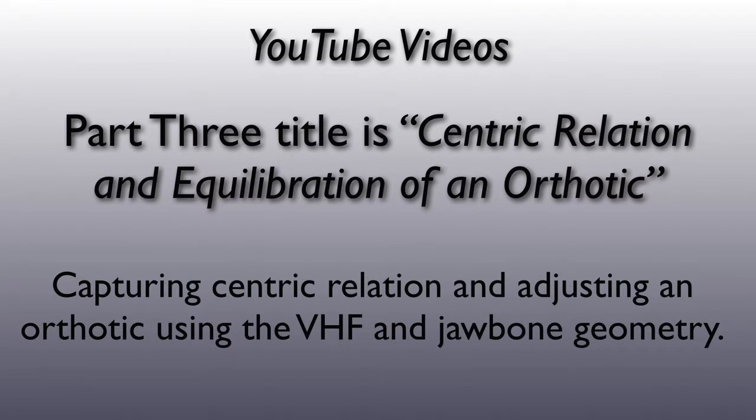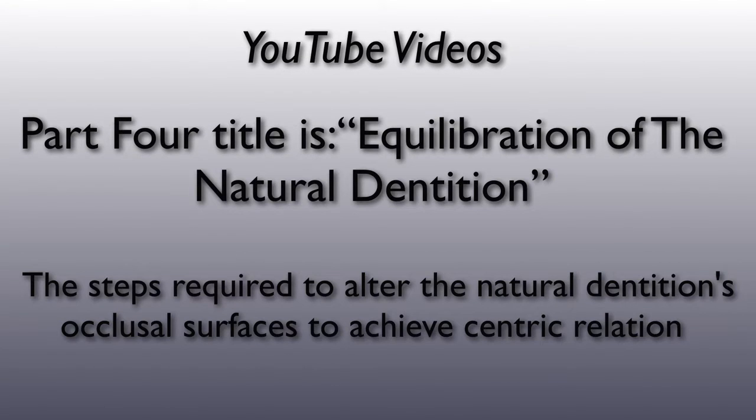Part 3 is titled Centric Relation and Equilibration of an Orthotic. It is about capturing centric relation and then adjusting an orthotic using the vertical holding fulcrum and jawbone geometry. Part 4 is titled Equilibration of the Natural Dentition.